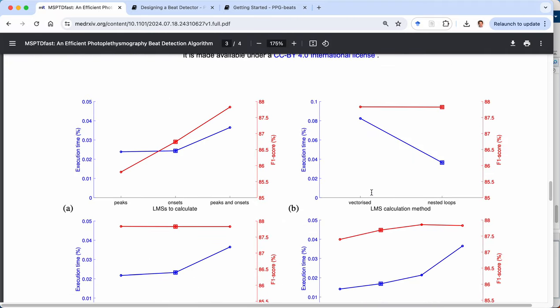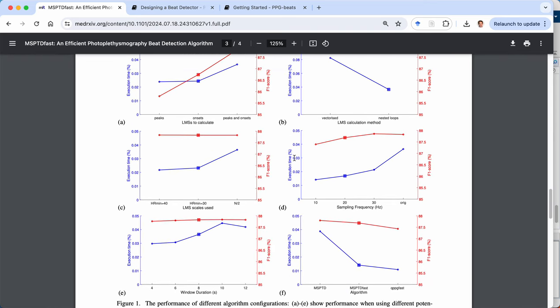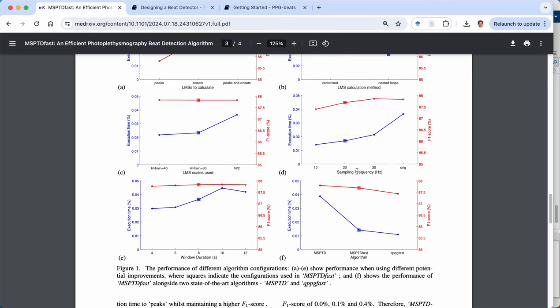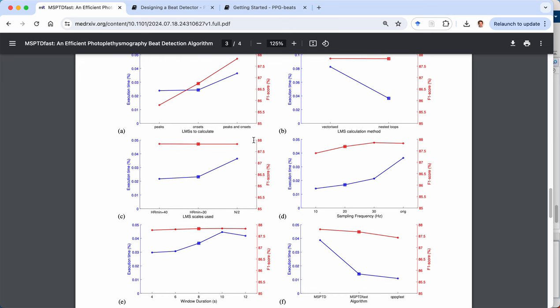So if we just come down to page three, there's a series of six different plots. And each plot shows the execution time on the blue axis on the left and the F1 score, a measure of beat detection accuracy in red on the right hand axis. And there are two lines, one for each of those metrics. And in each plot, we have the results when using different options.